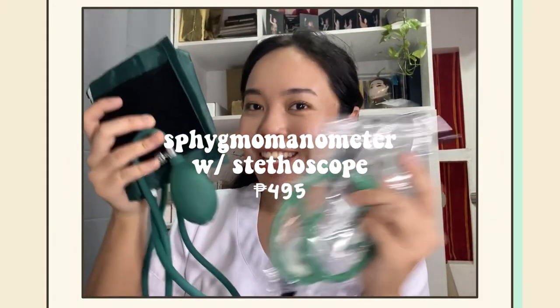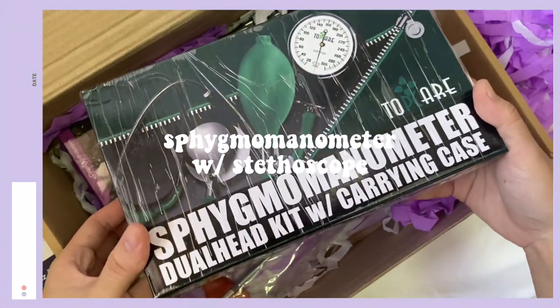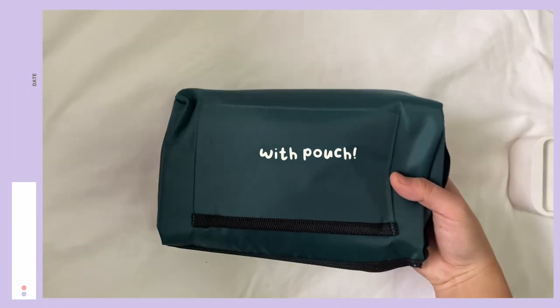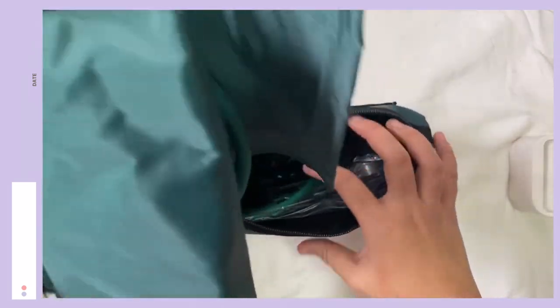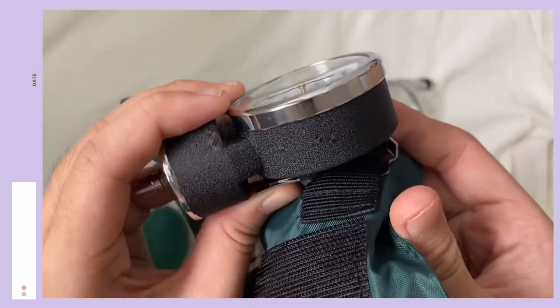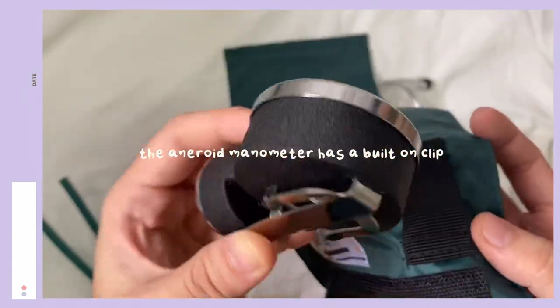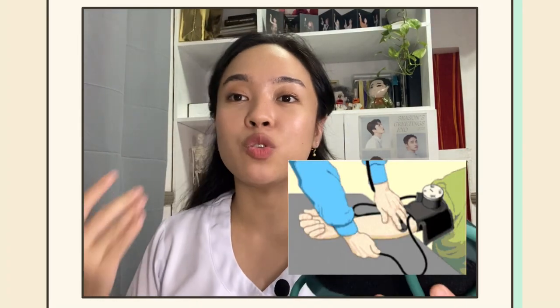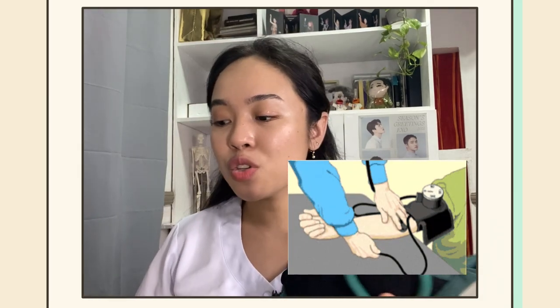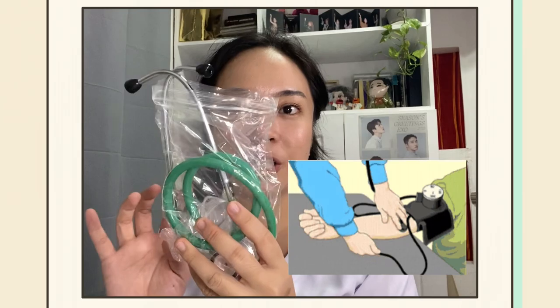This is a sphygmomanometer with stethoscope. To measure blood pressure, your doctor uses an instrument called a sphygmomanometer. This cuff is wrapped around your upper arm and inflated to stop the flow of blood in your artery. In combination with a stethoscope, it is commonly used when measuring blood pressure.